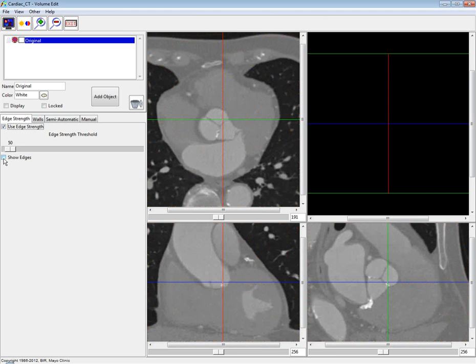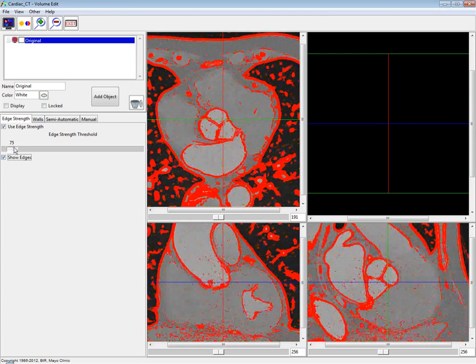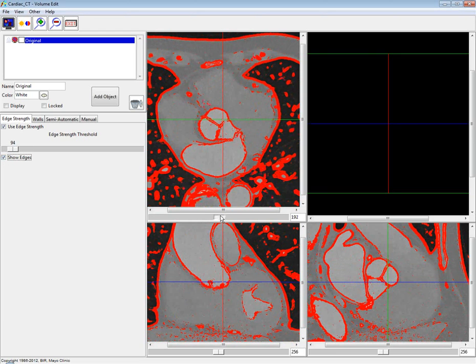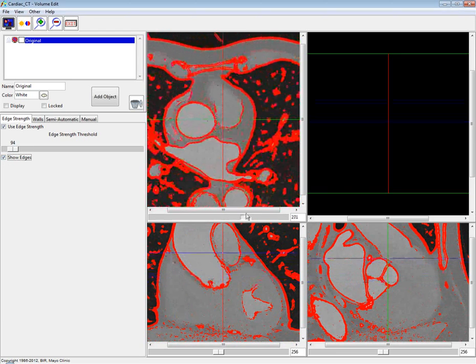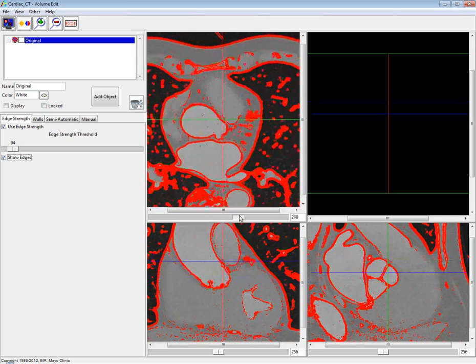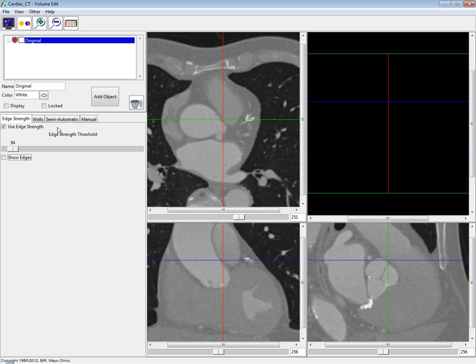You can also check the show edges option, which will show you the edges continually. This is useful because you can now move through your slices and review the edges to make sure your settings are set appropriately. Once you've selected your edge threshold, you just uncheck show edges and move on to your walls tab, where we'll see the next new feature.